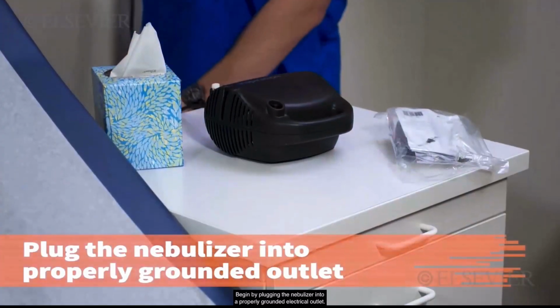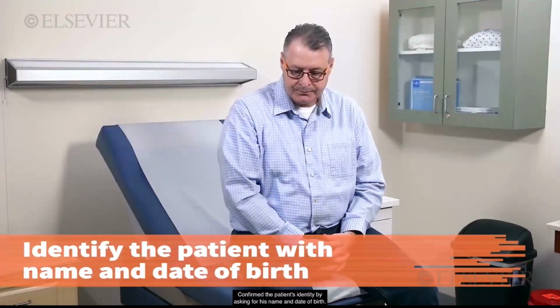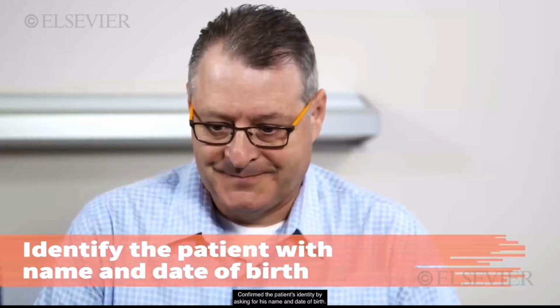In this procedure, you will learn how to perform a nebulizer treatment on a patient. Begin by plugging the nebulizer into a properly grounded electrical outlet. Confirm the patient's identity by asking for his name and date of birth.